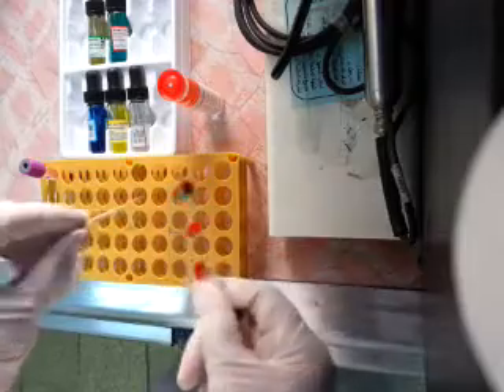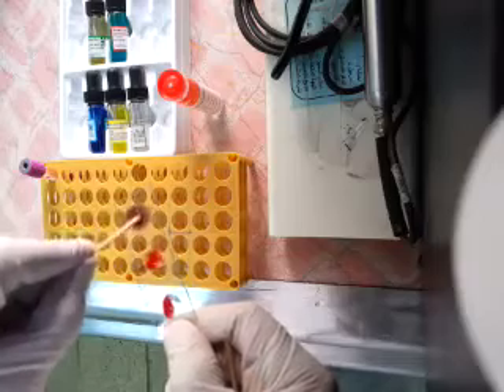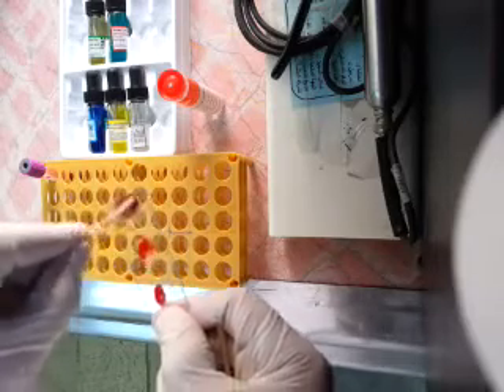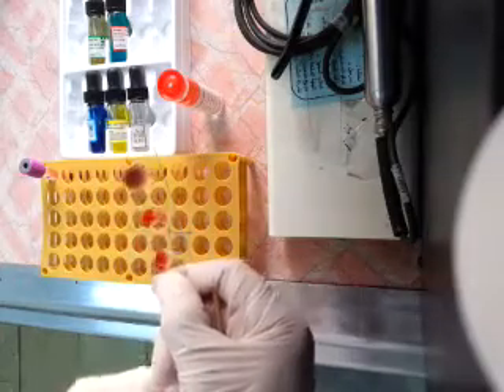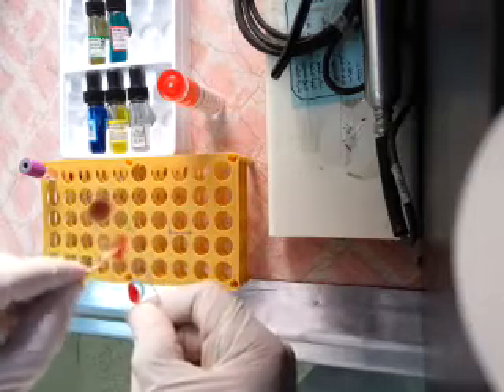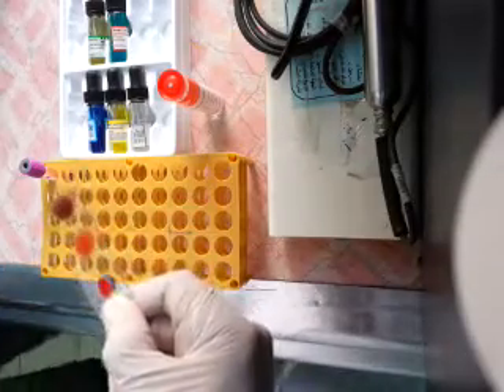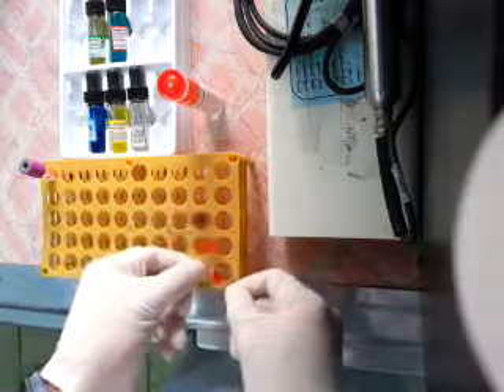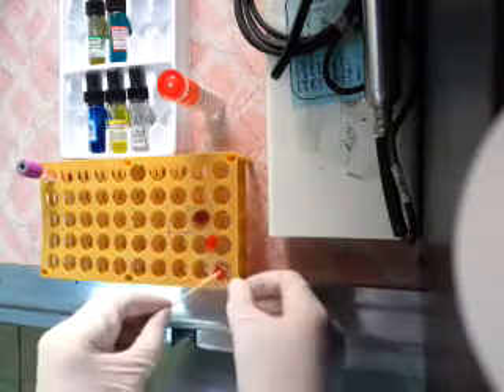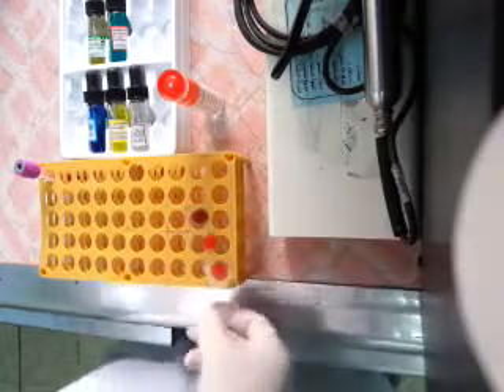We will make mixing. Next, we wait for agglutination. We tilt the slide to see agglutination for RH.